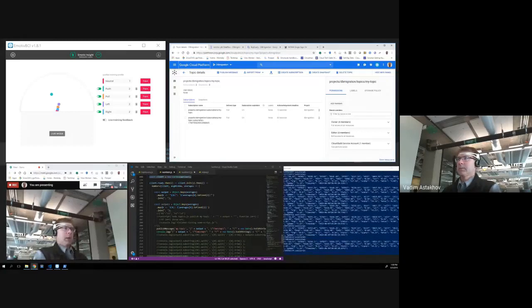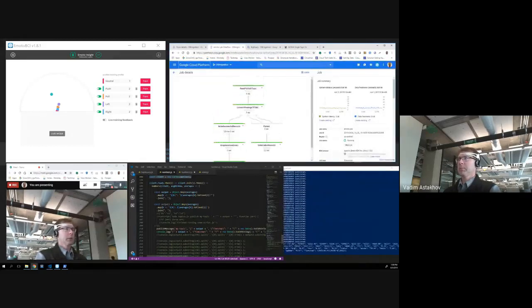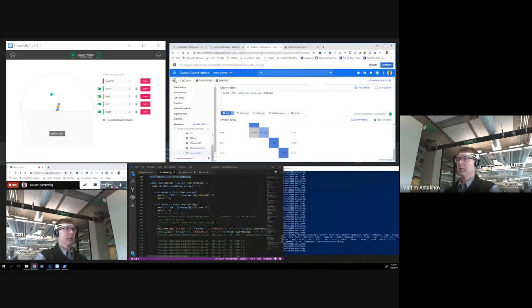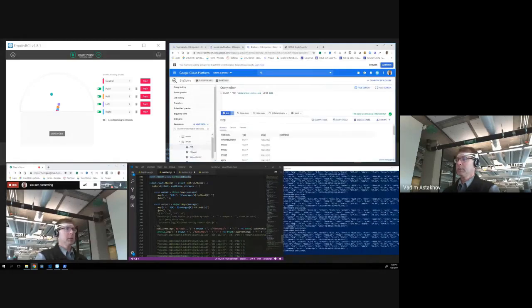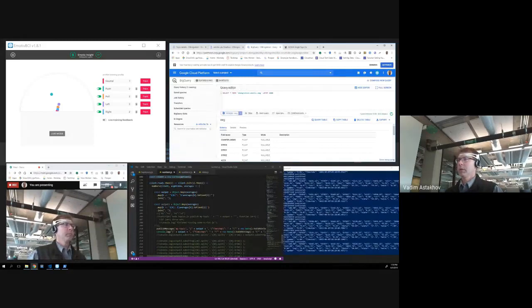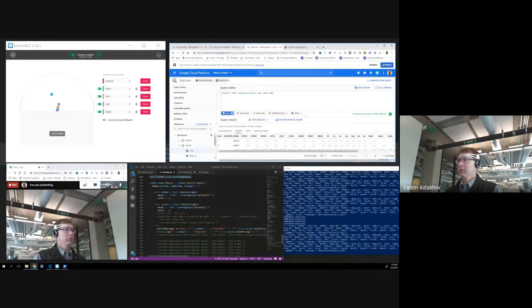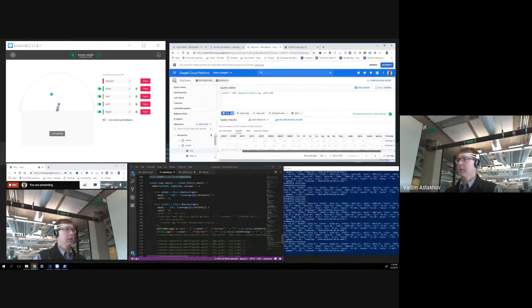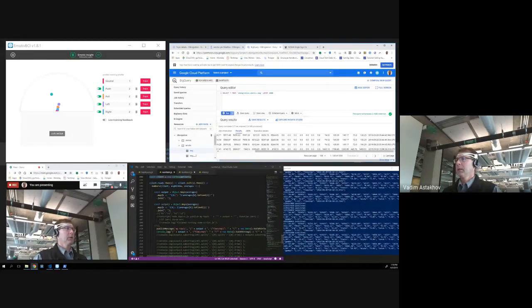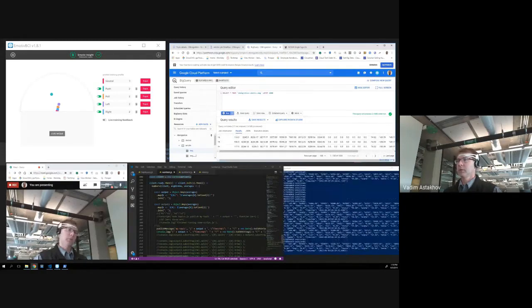The PubSub is pulled by Dataflow. I have a Dataflow that reads the data from the PubSub topic and populates a BigQuery table. So in the BigQuery table, let's query this table. In one of the tables, I keep the raw data, which is basically exactly the same data that you see on the right-hand side. It collects data from my alpha, beta, and gamma rhythms. It provides a timestamp. You can see the whole data and the data that I'm collecting right now. And it also provides some additional information like a gyro. So basically it's sensitive if I move my head, and I can use this information to filter the signal.